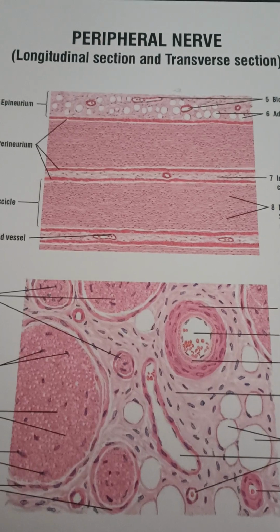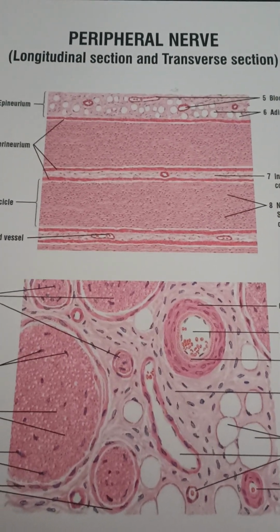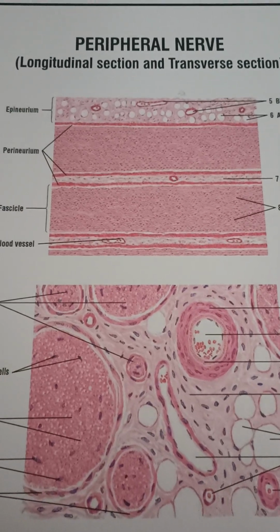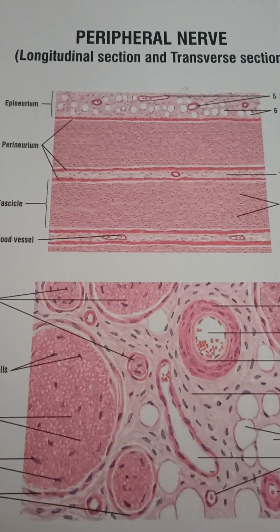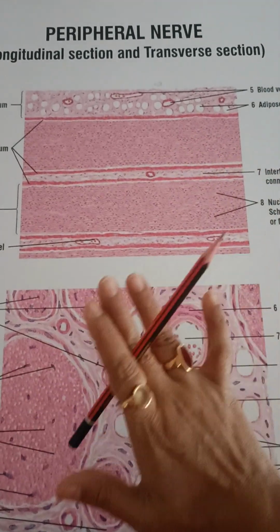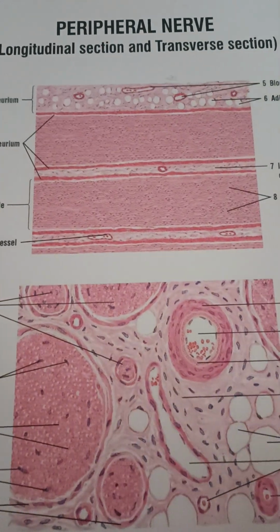This nervous tissue is stained by a special stain called osmium tetroxide, which is specially designed to stain the myelin and the fat tissue. It will make it appear black in color, but in this picture you can see it pink because here H&E staining is shown.